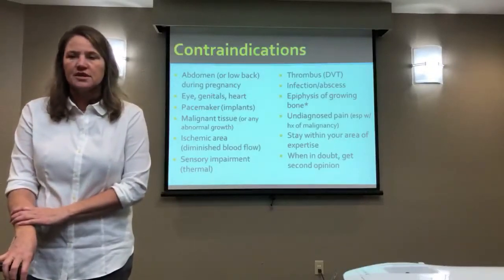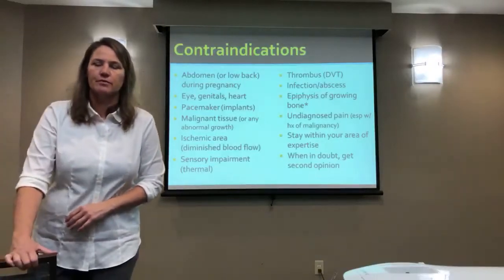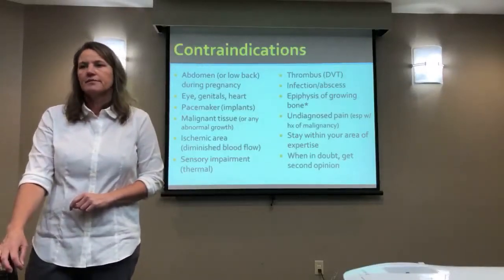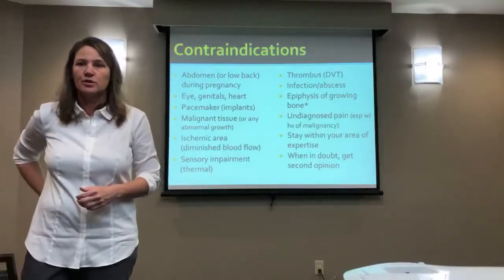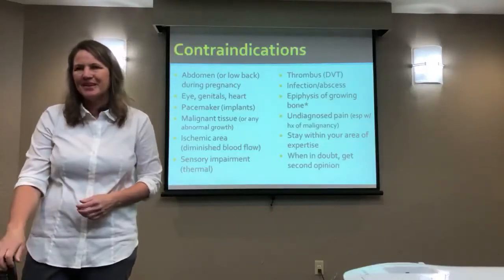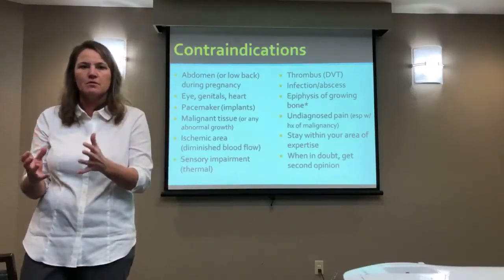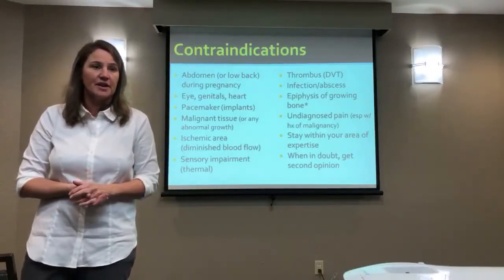I wouldn't want to ultrasound a growing fetus. I think about the production of cells in that. So you don't want to affect a growing fetus, so avoid the possibility of that. Now, could the ultrasound that I deliver, if I'm doing an ultrasound on someone's low back, get to their fetus? I seriously doubt it. But do I ever want to be in a court of law on somebody who had a baby that had a deformity of some kind and have to defend myself that I made that choice?